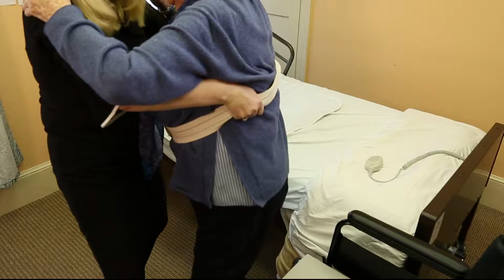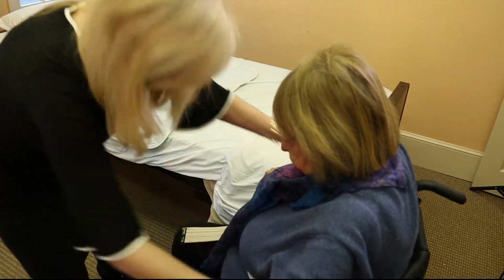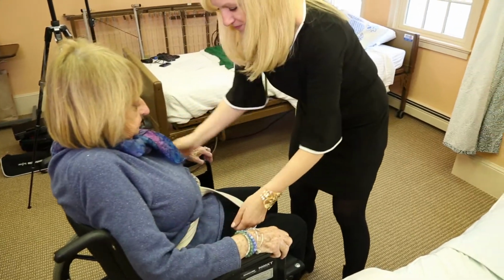Have the patient feel the wheelchair behind her legs and make sure that she puts her arms on the arms of the wheelchair before you sit her down.